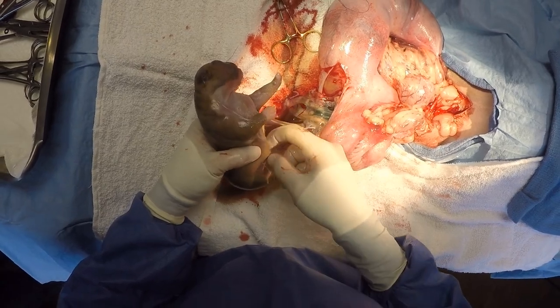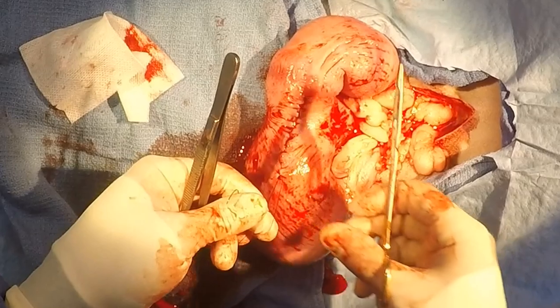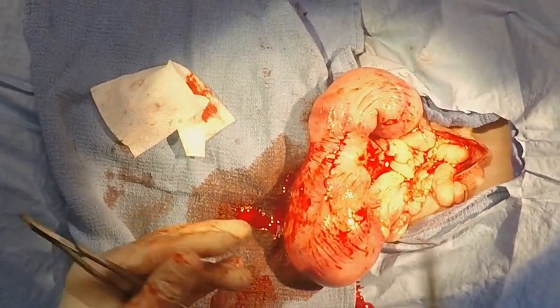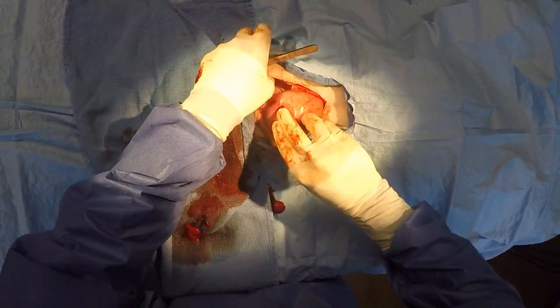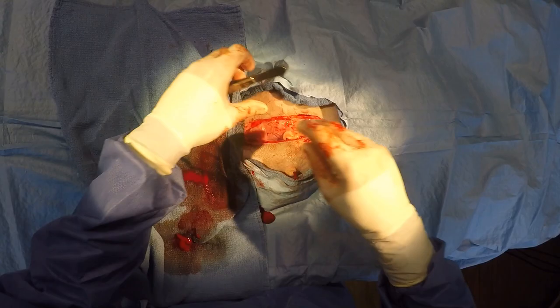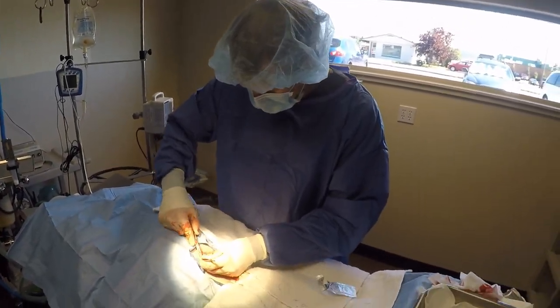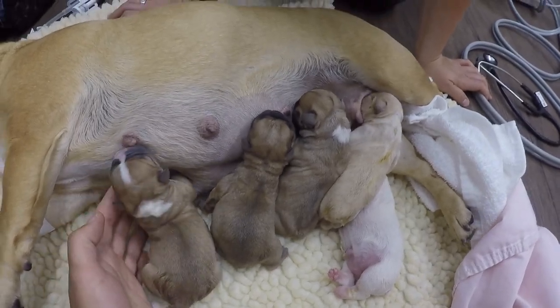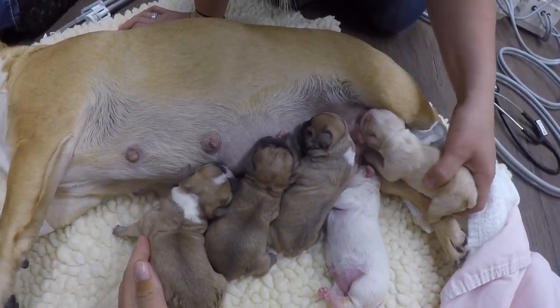Once all the puppies are removed, the uterus will then be closed and placed back into the abdominal cavity. The incision is closed — first the belly wall, then the subcutaneous tissue, and finally the skin. Once the mother is in recovery, the puppies are placed onto the mother in order to start nursing and receive colostrum and milk.